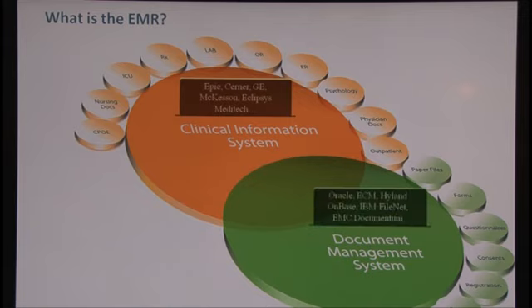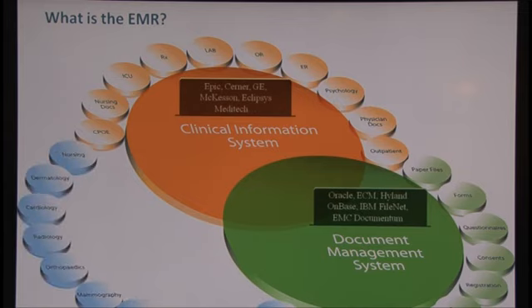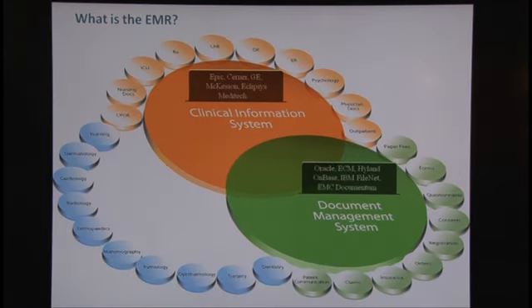Organizations also have imaging systems that are represented in individual departments. Most of these imaging systems are owned and managed by the department, but do not have an equivalent enterprise system that is on the level of the clinical information system or document management system for the enterprise. Each individual department may be creating images on its own.